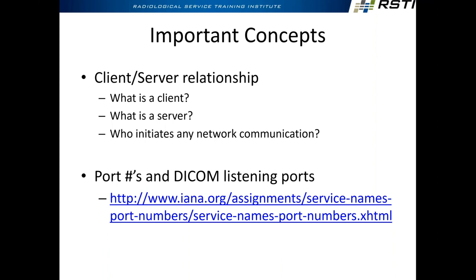And it may sound silly, but if you write the date, what's today's date? How do you write that? Month, day, and year. It can be year, month, day, or month, day, year, depending on where you go. So the whole point of DICOM is to take all this data that is shared amongst manufacturers and devices and standardize it. That's what DICOM does. Port 104 is registered to ACR-NEMA because they're the ones who created DICOM and set the standard.